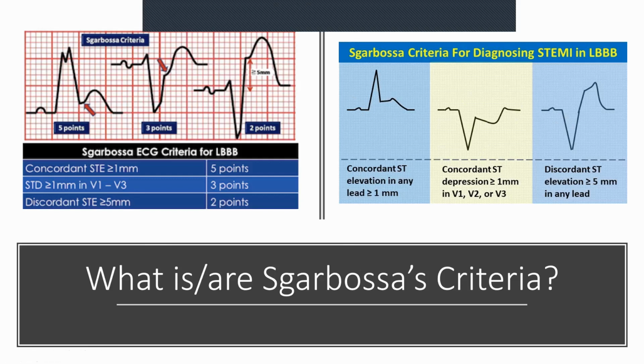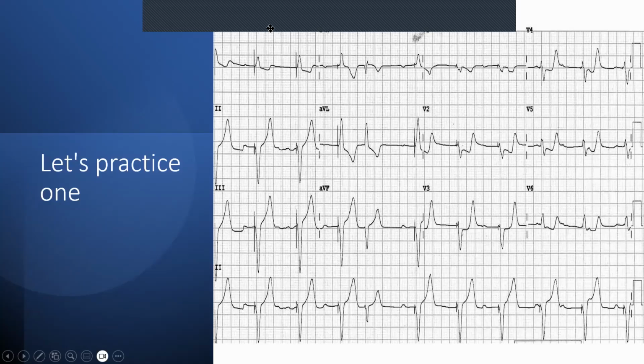Now, this is by no means an exhaustive talk about left bundle branch blocks and their pathophysiology and how you go through them. It's just merely to give you a basic understanding of how to go through it. There's a lot. You can go into left bundle branch blocks for hours, actually, but I don't want to overload you. So what I want you to do is rather have a look at this, understand this part of it, so that the next time you get a left bundle branch block, you now know what to concentrate on.